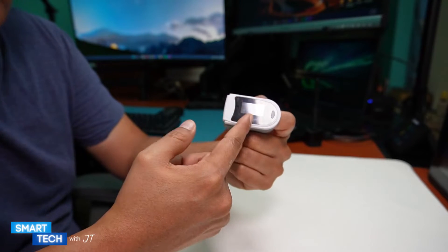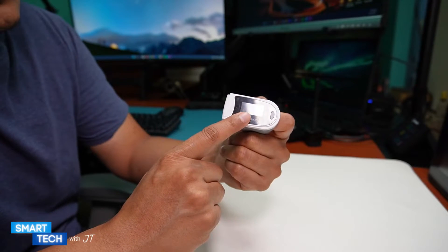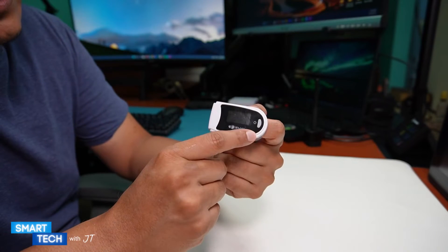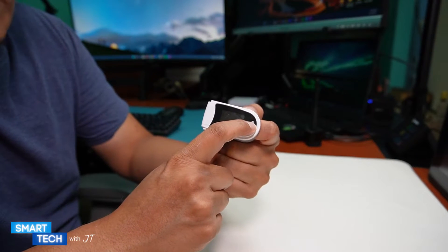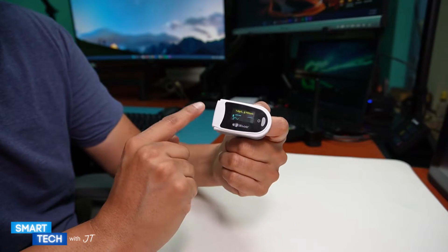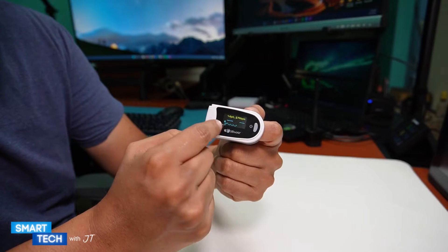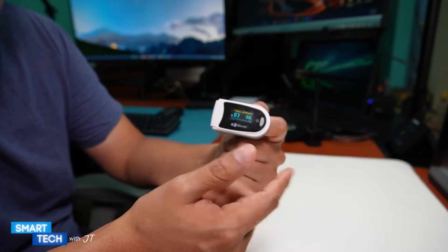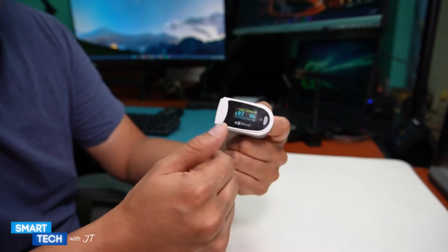I suffer from sleep apnea and that's what caught my attention when I purchased this. All you have to do is turn it on and it will read, and then after a couple of seconds it will shut off and continue to register your oxygen level and your heartbeat.